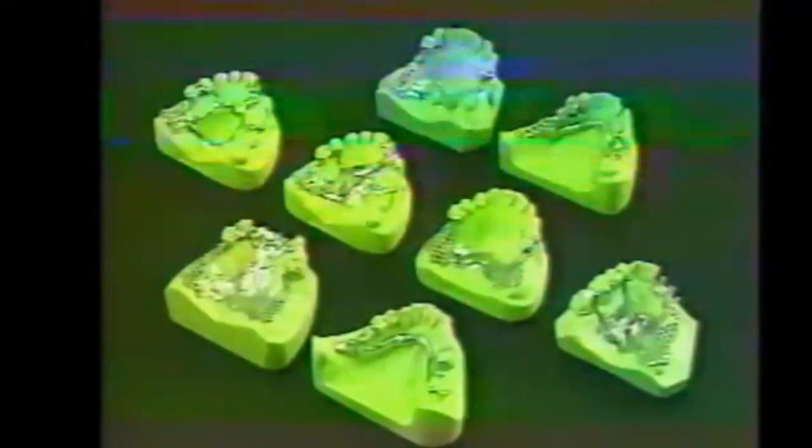Thus, it is possible, with carefully tailored process technology and appropriate materials and equipment, to achieve reliably reproducible results. The work is finished in the dental lab and then inserted by the dentist.